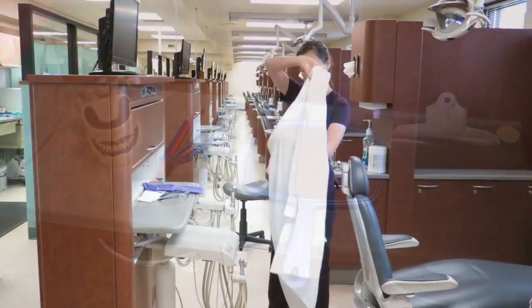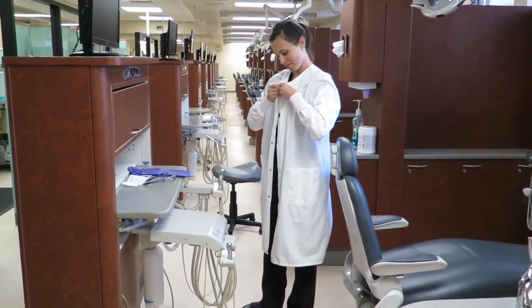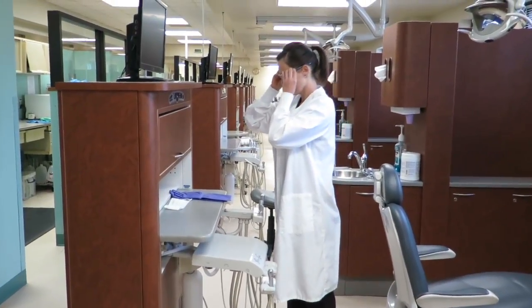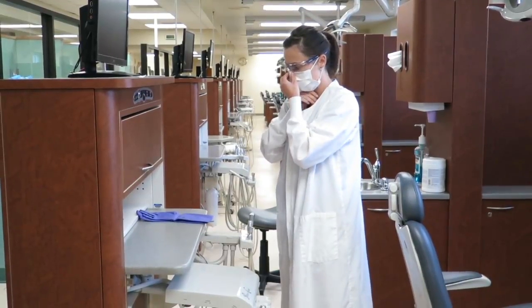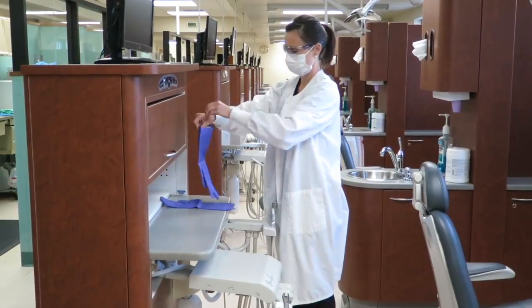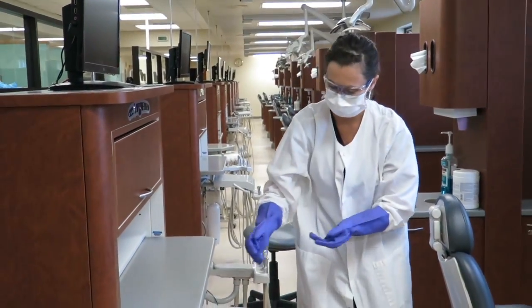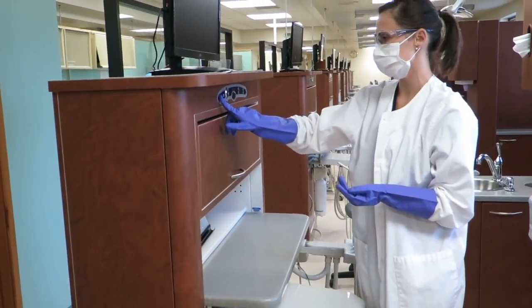Next, we will don all personal protective equipment to include your jacket, eyeglasses, mask, and nitrile gloves. We will then turn on the unit in two areas. Set your timer to help you keep track of your time.